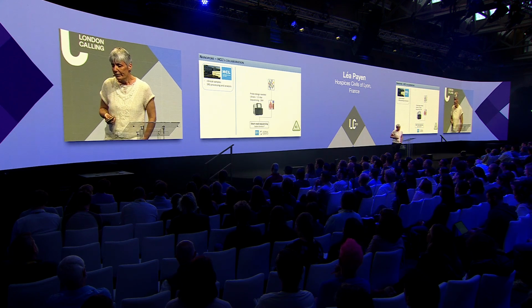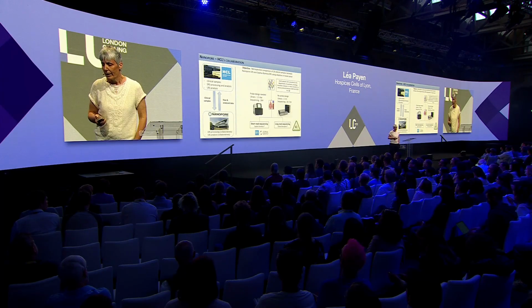We sequence the sample using our certified workflow. It's a short-read sequencing method associated with the bioinformatics from SOPHIA Genetics. It takes at least 5 to 10 days to release the result.